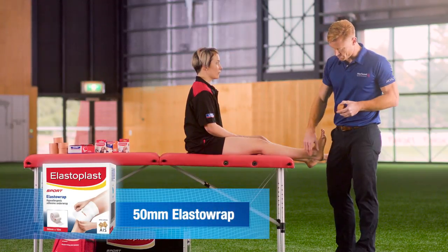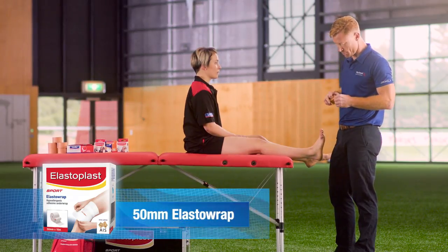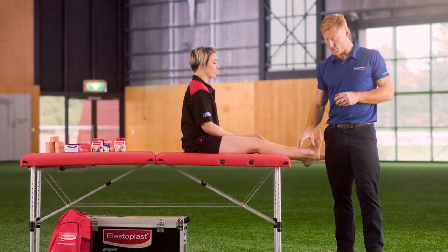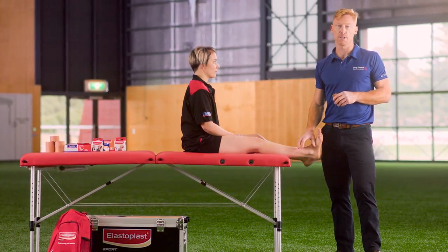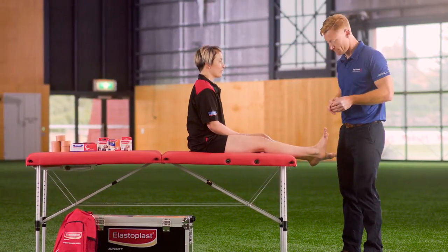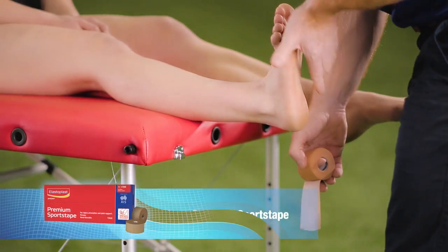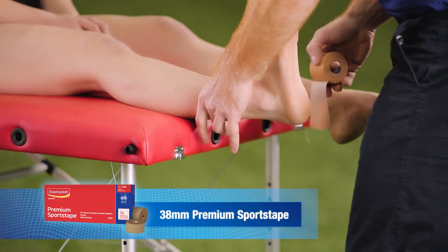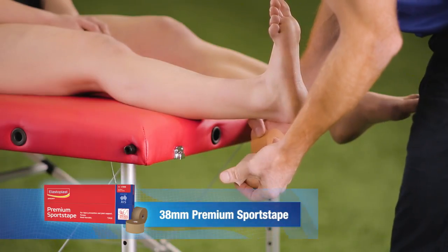Today we're doing a lateral ankle taping procedure to support the lateral aspect, or the outside, of the ankle. We use this following an ankle sprain injury throughout recovery and rehabilitation, and also to prevent the likelihood of further injury. We start by asking the patient or athlete to pull their toes towards their knees to maximize the diameter through muscle contraction, to prevent tape cuts down the track.